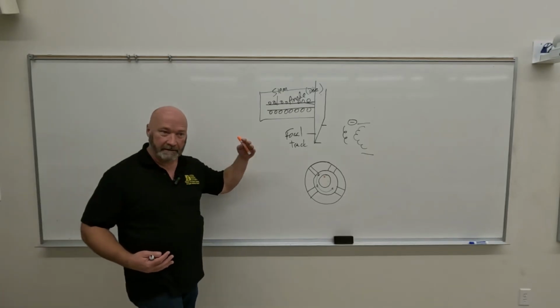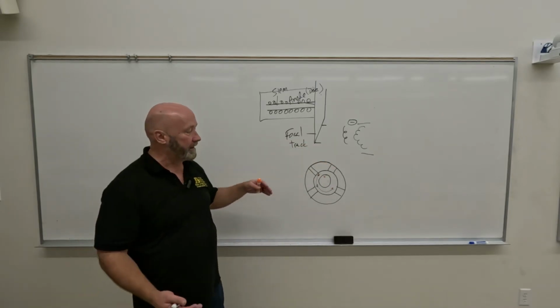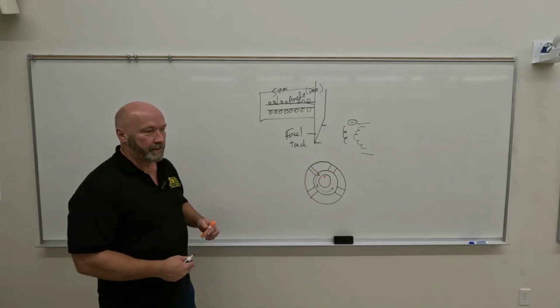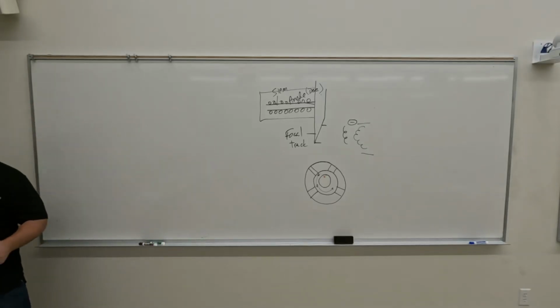So it's an important thing to understand. You're never going to see it on a test question, but it's important to understand that the tungsten does not warp. And that's a big reason why we use it. There are a number of reasons why we use it. That's not in the textbook, but we're going to get to the other ones directly.